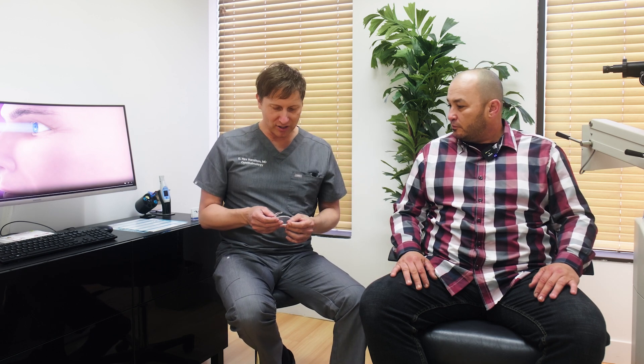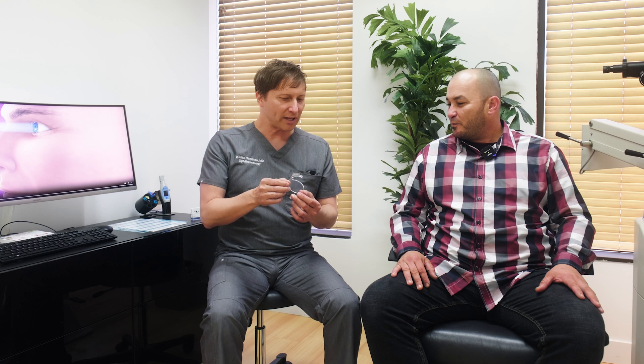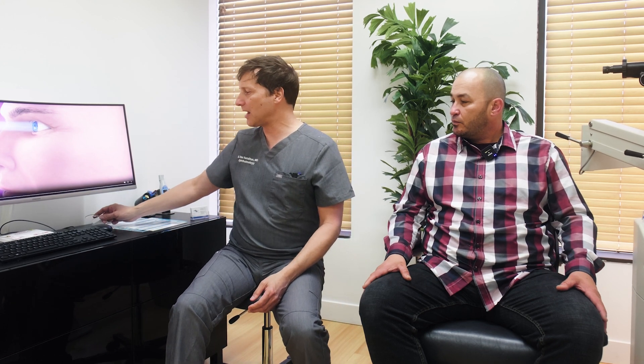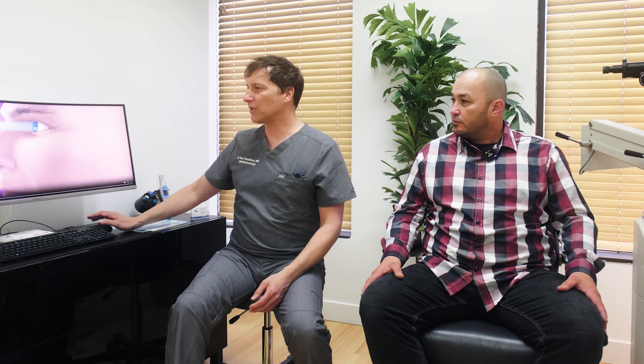I just wanted to show you again — and for folks watching, this is what a lens implant looks like. The real one is much smaller than that, but the light adjustable lens really looks exactly like this. It's very different than a standard traditional intraocular lens implant. The difference is that there are what we call macromers — molecules that are suspended in the material.